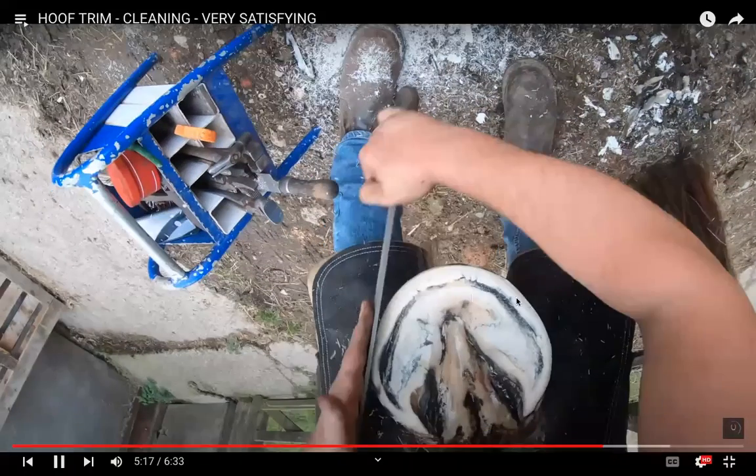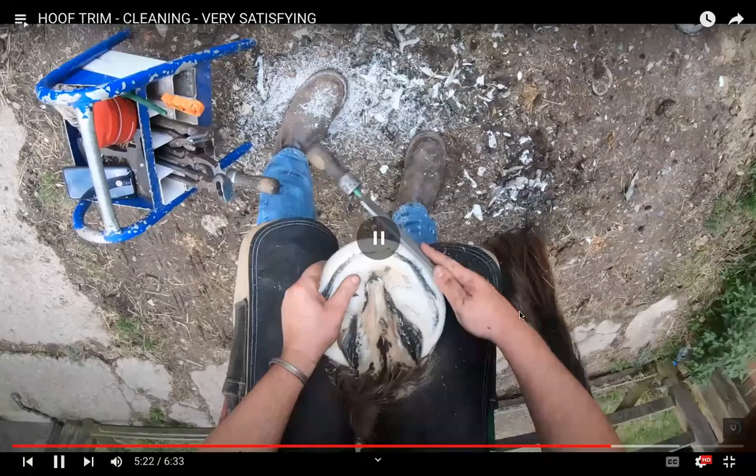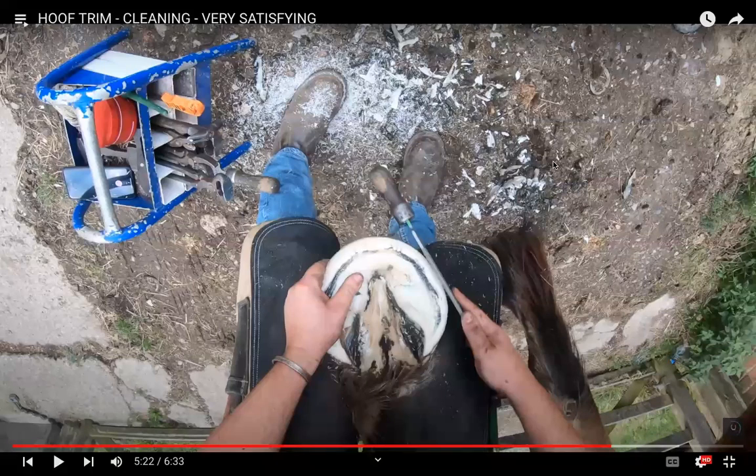Goes right around that hoof, makes it all nice and smooth. So he's going to keep doing that for the entirety of it. They don't show you a finished product, but as you can see, all the hoof that he's trimmed away, that is successfully a shod of a horse. So when we trim their hoof, we're going to be trimming, and then if we apply new shoes, that's going to be a shod.